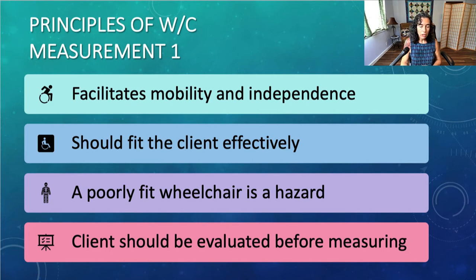It includes strengths and deficits, things like range of motion, muscle strength, mobility, any kind of medical issues that are going on, etc. And I do have a video that's linked to this slide deck that shows evaluation for a wheelchair, as well as some of the fitting.